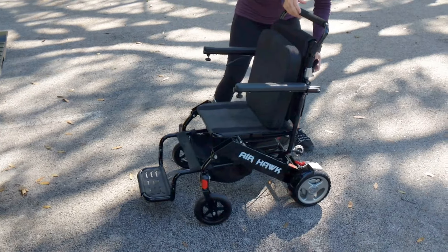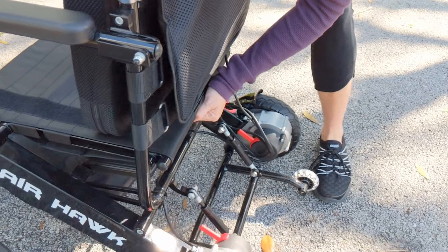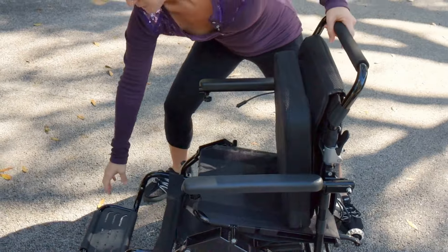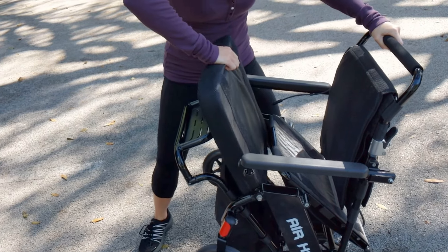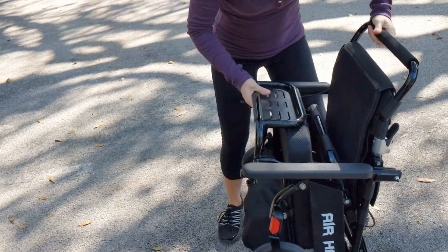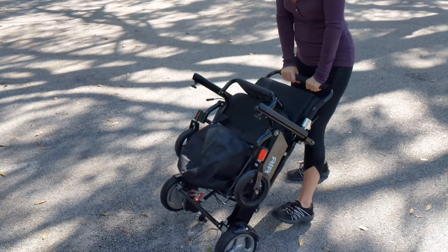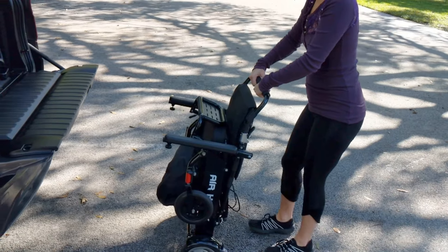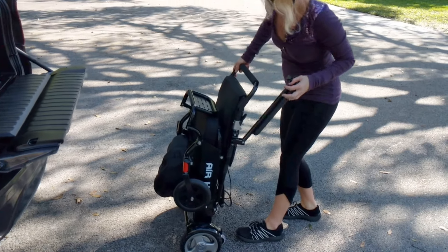We're going to very easily manage the cushion here. There's a safety mechanism in the back of that chair that disengages the seat. Going to pick the chair up — that cushion goes so easily underneath the seat. Look how tight that folds up. We're going to fold the arms right behind the chair as well. Very simple, very easy — makes it totally compact and simple to operate.